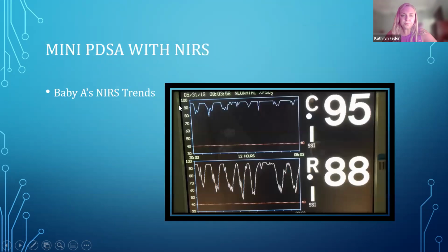So we placed the NIRS monitor on him just to do this mini PDSA in our unit and make sure we don't need to know anything more about these probes before we roll this out. So this is what we found.